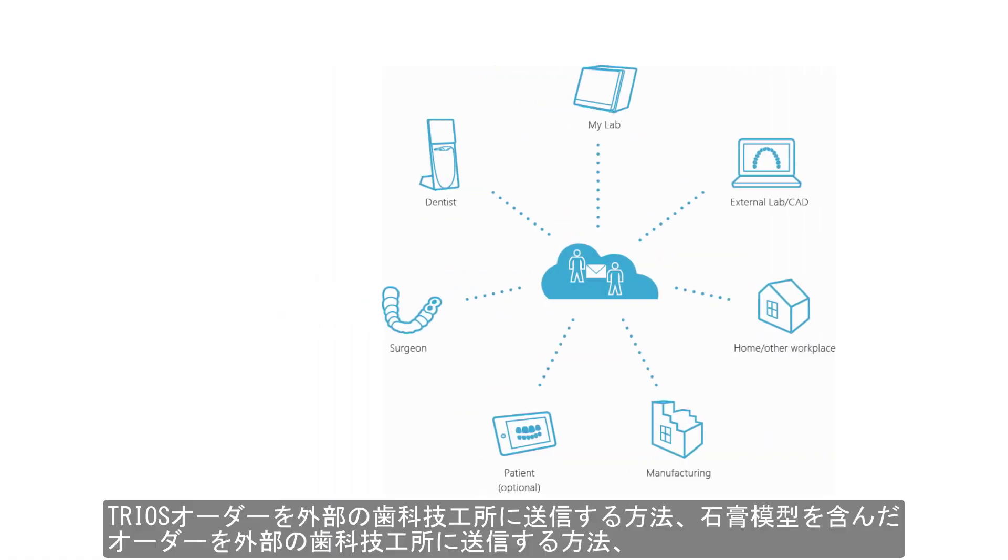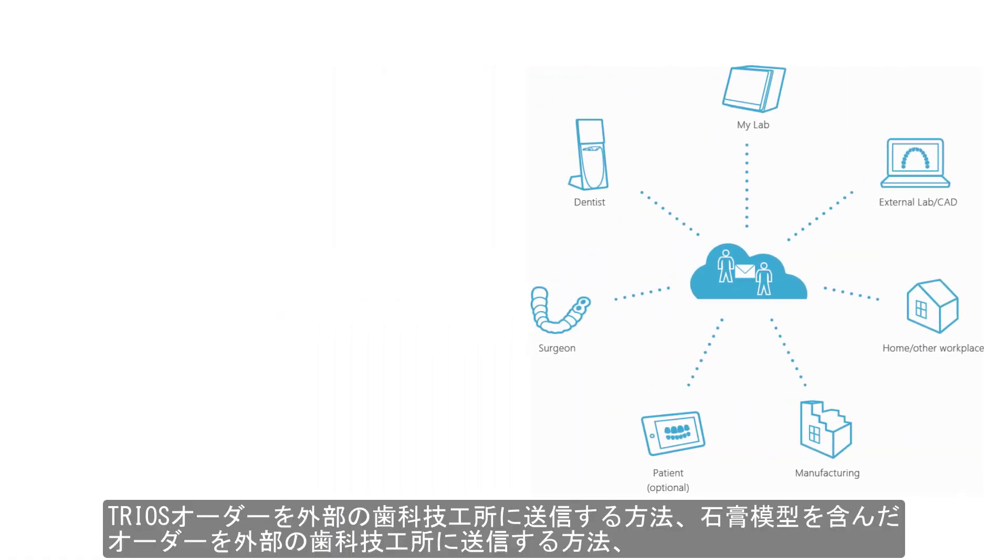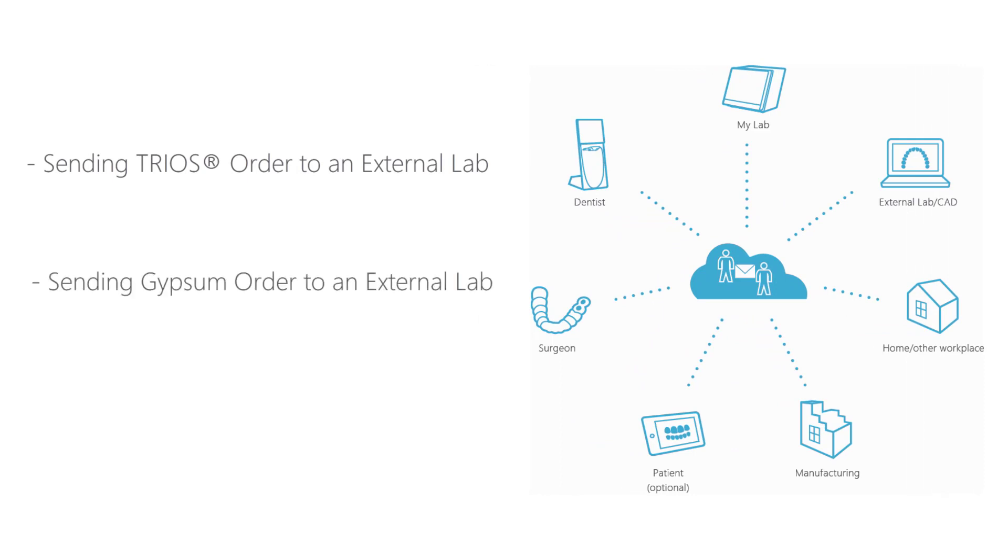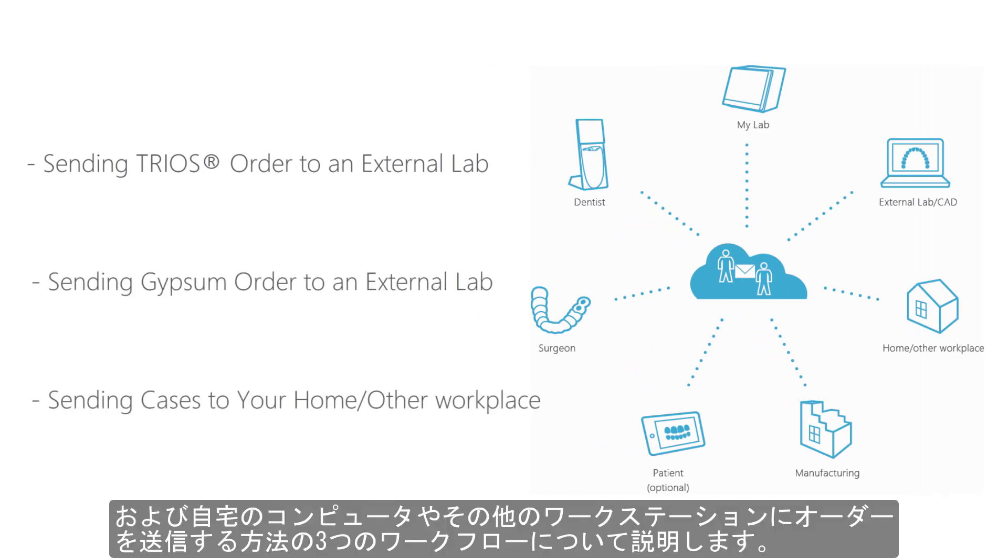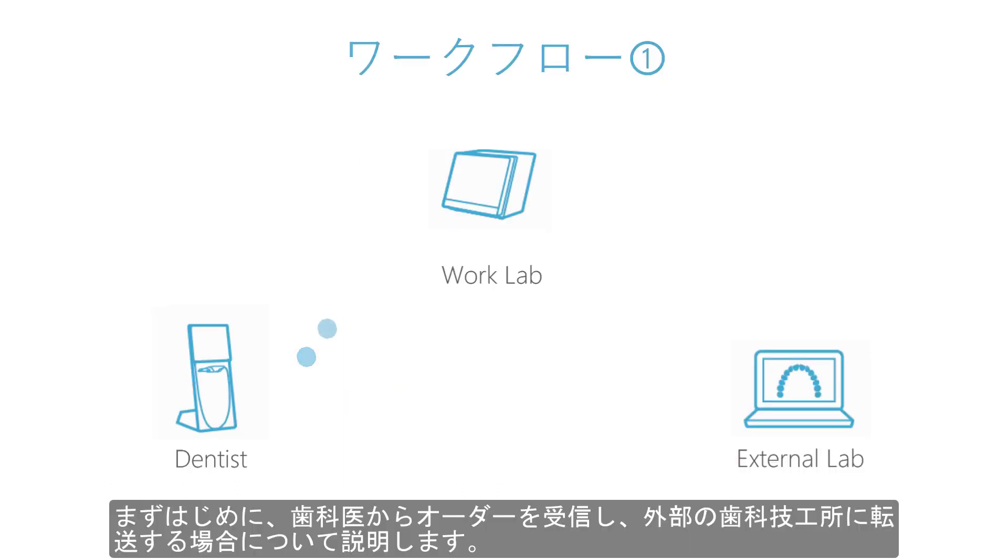We will show you three scenarios: how to send a TRIOS order to an external lab, send a gypsum order to an external lab, and send cases to your home PC or other workplace. Let's explain the first scenario, getting an order from your dentist and forwarding it to an external lab.